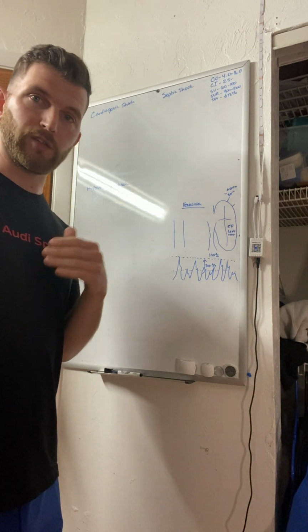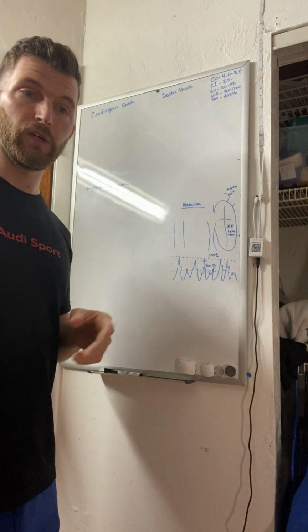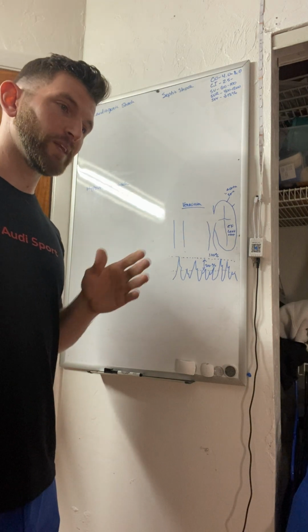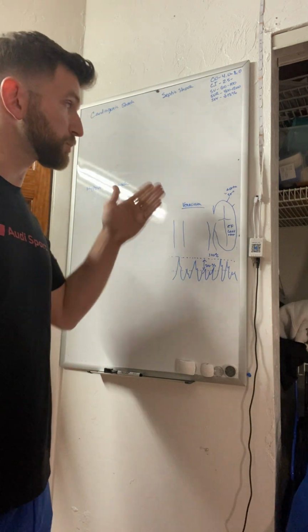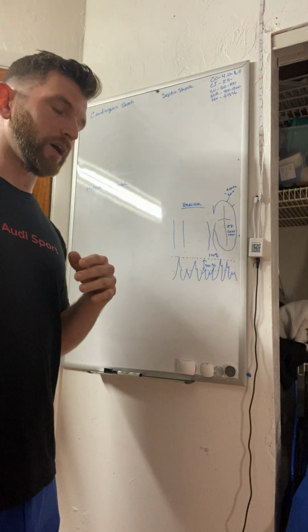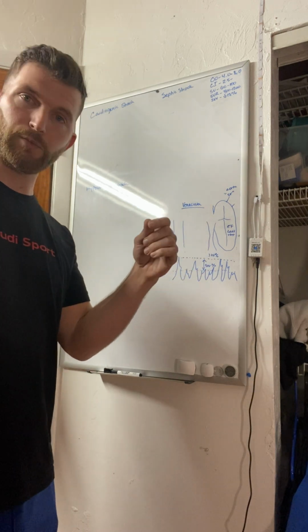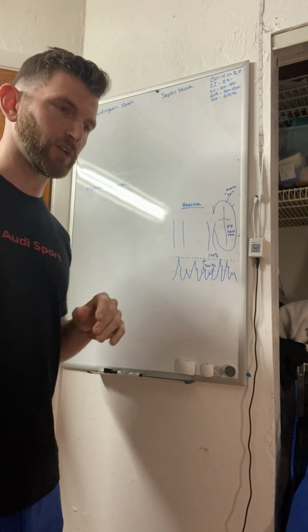But if the person has a perfect echo, they don't have any physiological symptoms or signs that you can see, then it may not be cardiogenic shock just because the stroke volume is low. It may be the arterial line waveform. It may be that the arterial line isn't placed in the exact spot it needs to be. Maybe the patient's bending their wrist. There's a lot of factors to consider there.